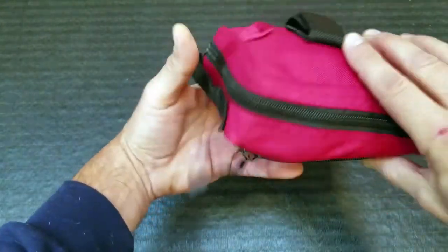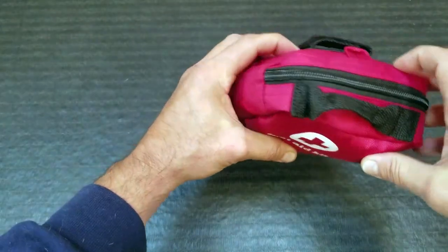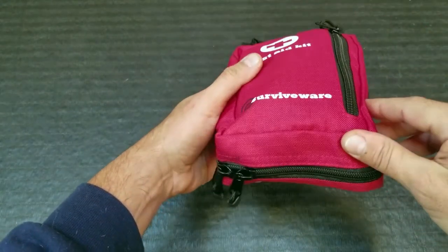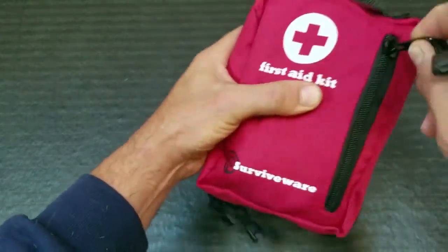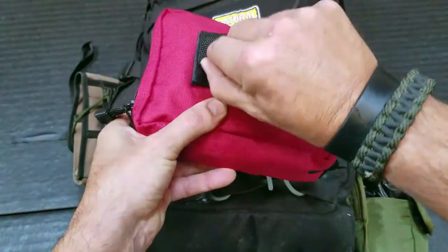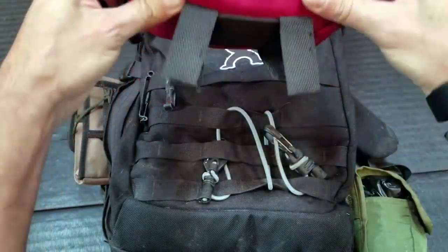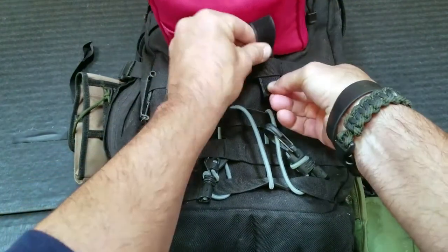Right off the bat, one of the things that impressed me with this kit is the actual bag that it comes in. A lot of times, these first aid kits, the bags are lacking in quality, to put it politely. With this one, you're actually getting 600D polyester, so it's nice. The zippers themselves are pretty strong — definitely feel like they're going to last a while. It also has a little Velcro attachment with some loops, really put on here solidly, so it's not going to fall off, and a perfect little setup to attach to your MOLLE webbing on your pack, whether it's inside or outside.